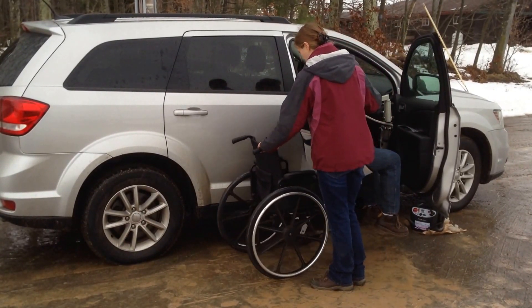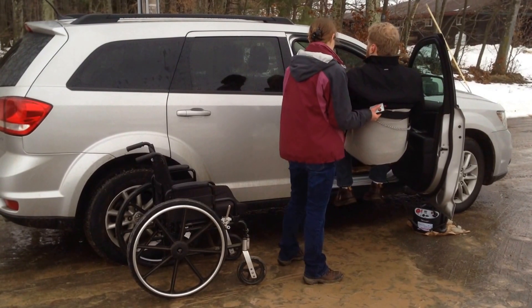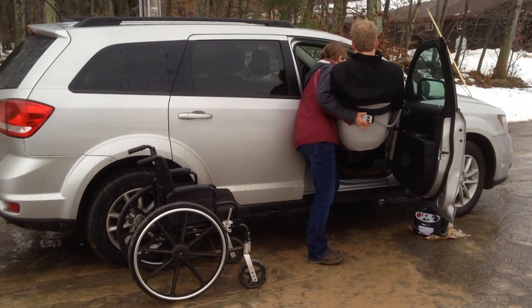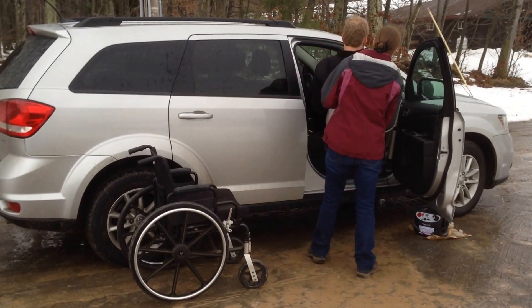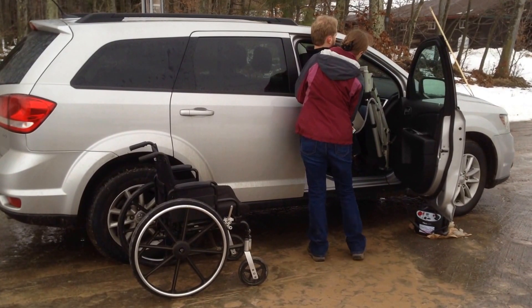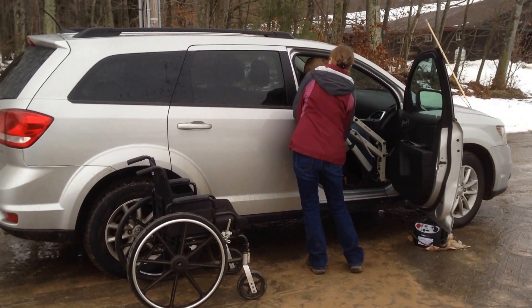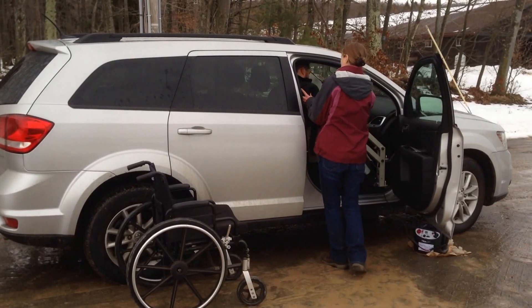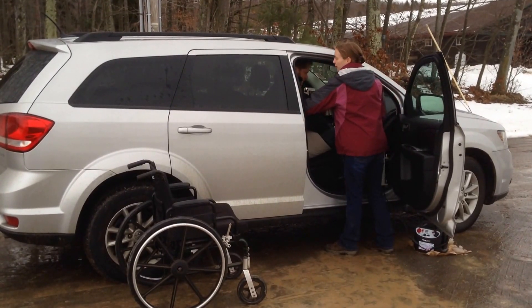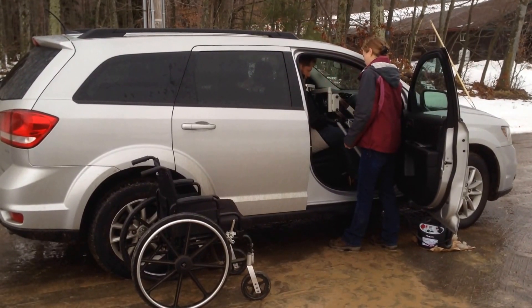Once he's clear of the wheelchair, I'll move that out of our way. I'm going to turn him to face the door opening, then slide him towards the driver's side and get his feet in position. Then I'm going to position him hips first and position him over the seat halfway. Lower him so that his head can get through the door and raise him over the seat. Once he's over the seat, I can either lift on the back of the sling where the handle is, or push backward on the knee so that he's over the seat and sitting straight up as I lower him.